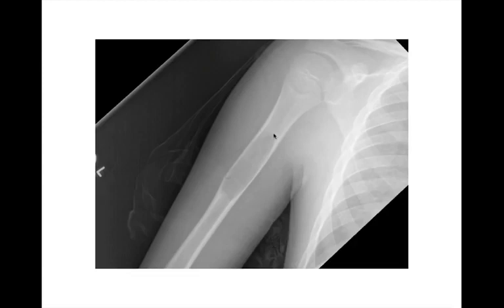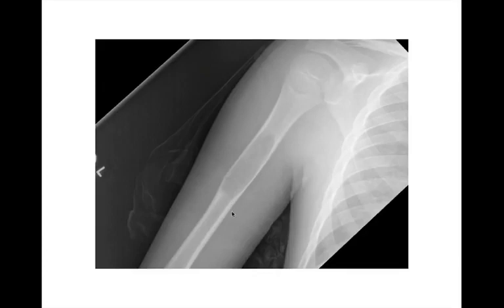Another humerus: geographic lytic lesion, non-sclerotic border, centered in the diaphysis of the proximal humerus. This one also has a pathological fracture through it, and here's your fallen fragment sign — pathognomonic for unicameral or solitary bone cysts. These lesions are centered in the diaphysis or sometimes the metaphysis of the long bones. When you see the fallen fragment sign, this is classic for unicameral or solitary bone cysts. Also note this is a young patient, which is the age range these occur in.